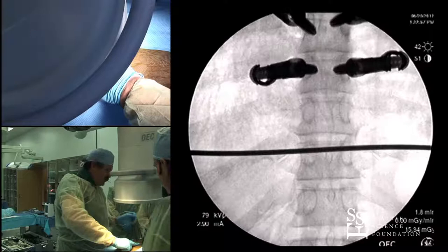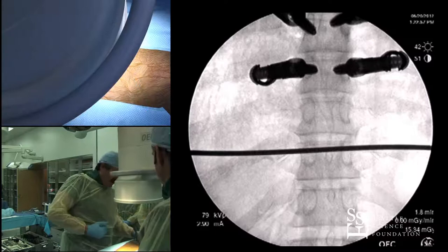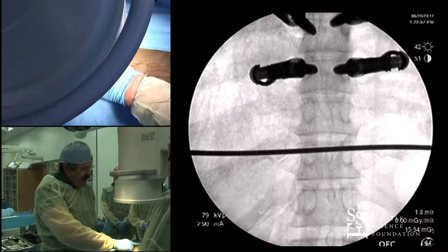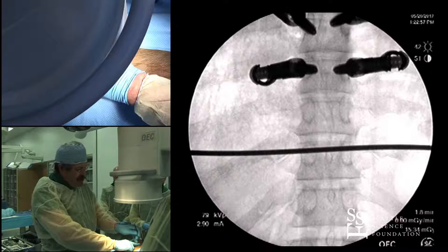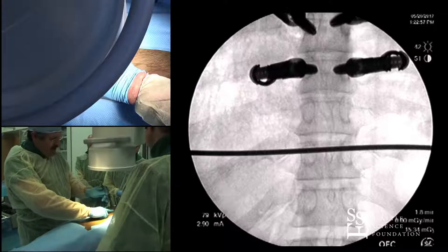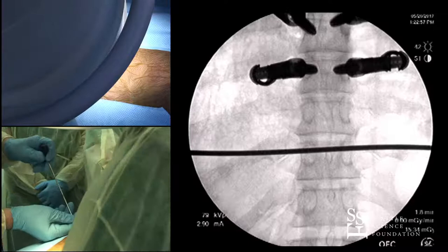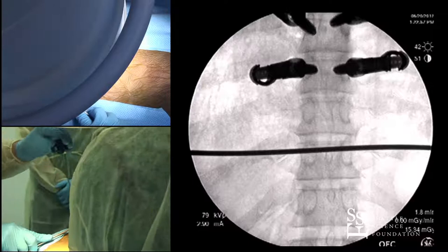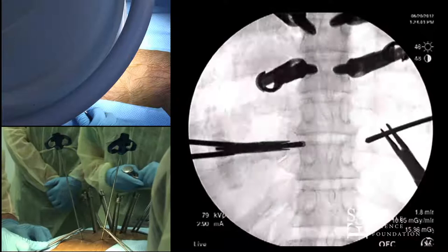Once I have the AP, I'll mark the skin with a marker. I want to minimize my fluoro — I don't make a lot of pictures. I'll use my fingers and feel the spinous process between them. Usually it's about two finger-breadths out in the lumbar spine; on this patient it's about one and a half finger-breadths out. I'll make stab holes — just two stabs. These Jamshidi needles are the long ones; I normally use a shorter one, but they'll work.